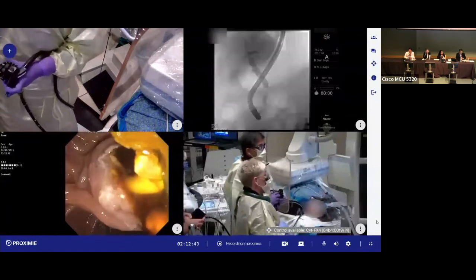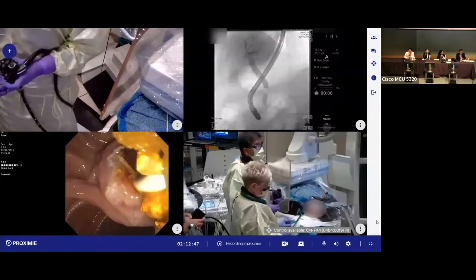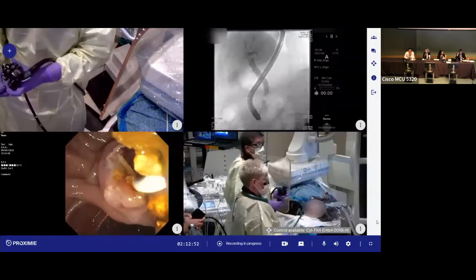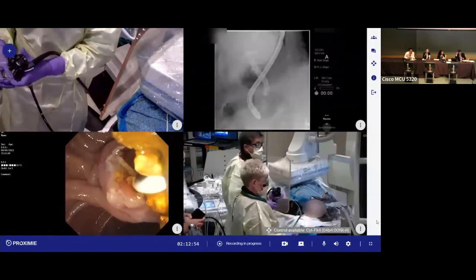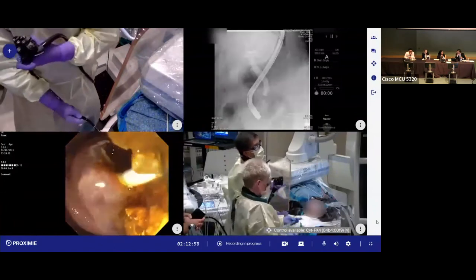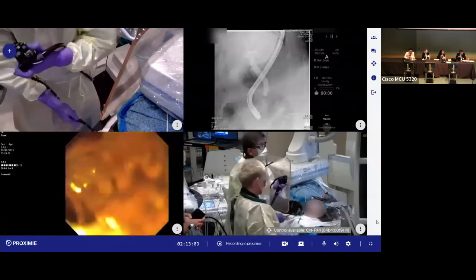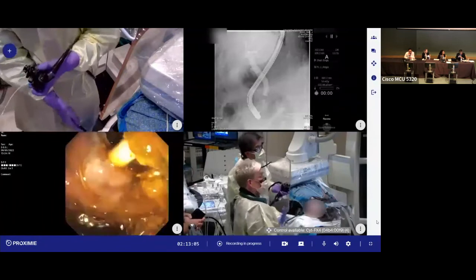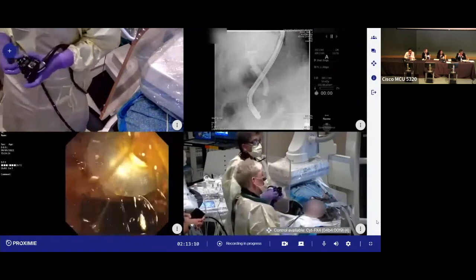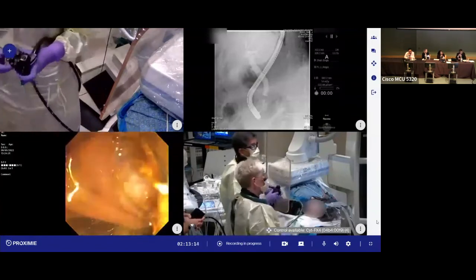Do you mind talking about that data? I know you're familiar with it, that sterile saline irrigation. Go to 9. In patients who have multiple stones removed, I'm sorry, Raj, I was caught on a call. Can you tell me what the question is again? The data on the sterile saline irrigation after stone removal, of multiple stone removal in a markedly dilated duct, and how it can reduce the risk of stone recurrence.